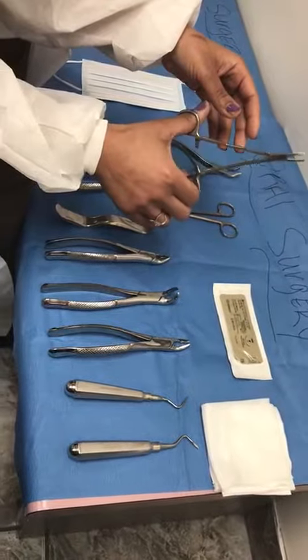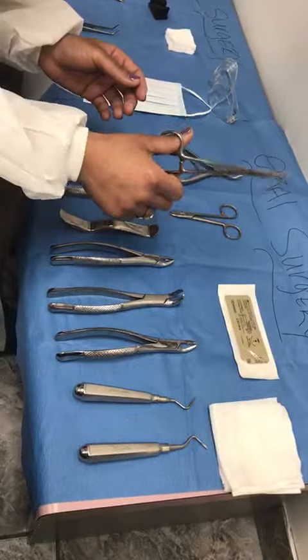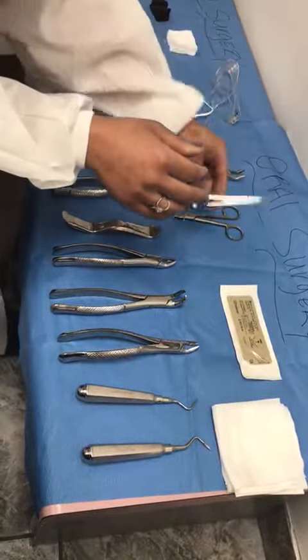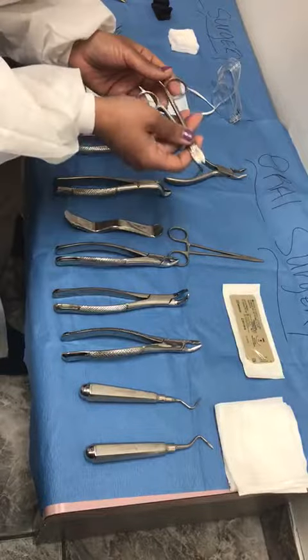We call the hemostat a needle holder also, because it can be used to hold these sutures. So when they're placing the suture, this tip holds it in. This is scissors that we use — we use it to cut the suture once the tie has been made.